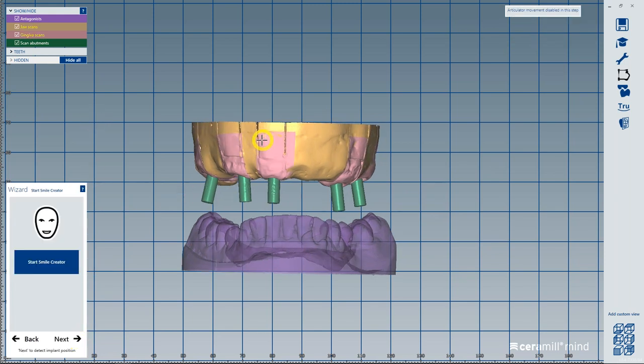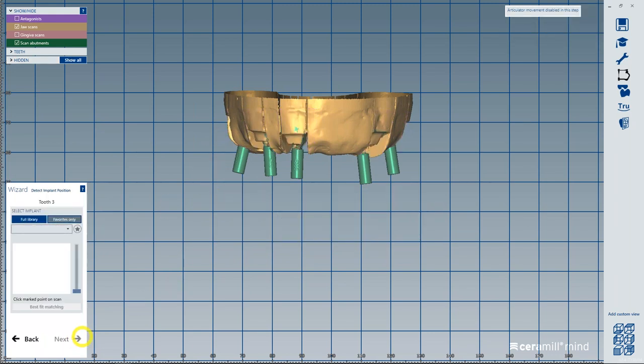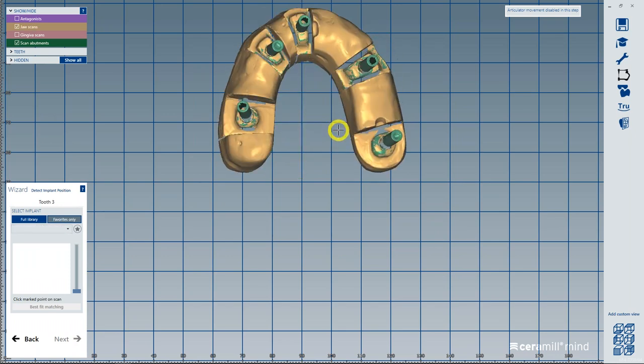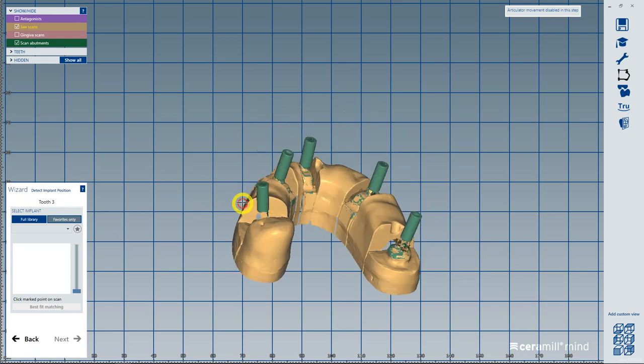If we were going to use a smile creator, this is where in the workflow it would be added, but we're not going to do that right now. We'd be here for 2 hours instead of an hour. So we'll follow the wizard, and the wizard says to detect implant position.